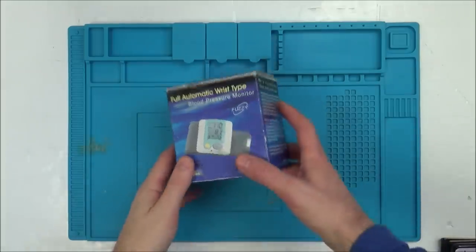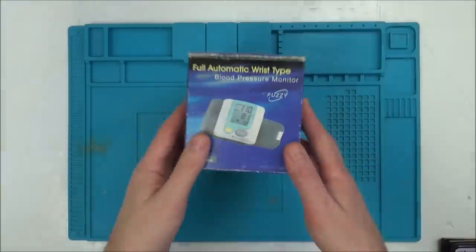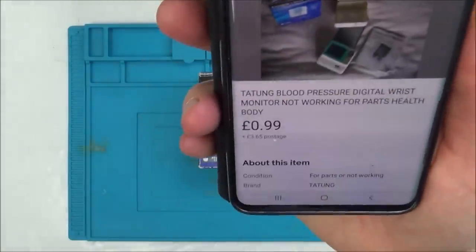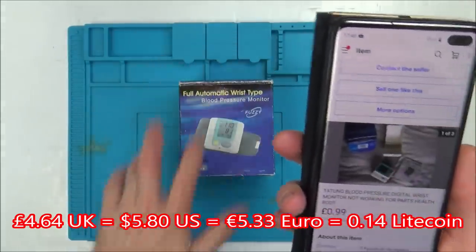Hi there, my name is Vince from mymakefence.com and in this video today we're going to try and repair this blood pressure monitor. I got it from eBay, it only cost 99p, but I did have to pay £3.65 for the postage because the box is quite big.